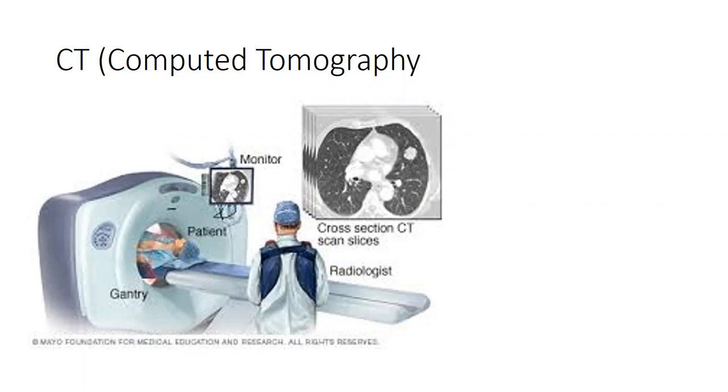It's a lot of radiation, okay? Radiation is something we take really seriously. And if there's any one message that I want you to come away from today, it's image gently, okay? When you order a series of x-rays, you want to think about, why am I ordering all these x-rays? You want to try to be as specific as you can. Sometimes you need 3 or 4 x-rays to make the diagnosis and make sure there's not other pathology.